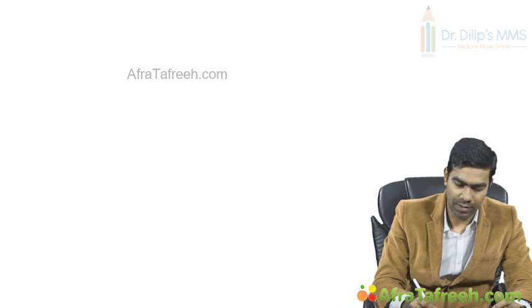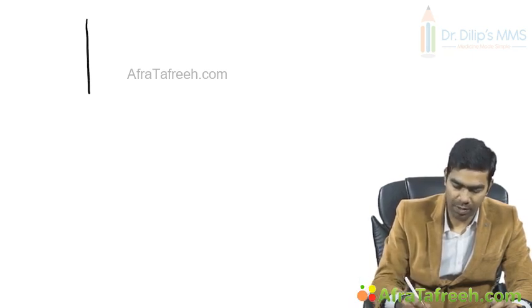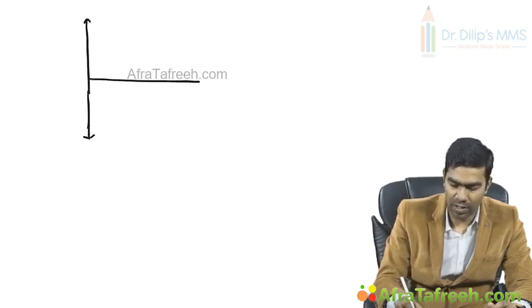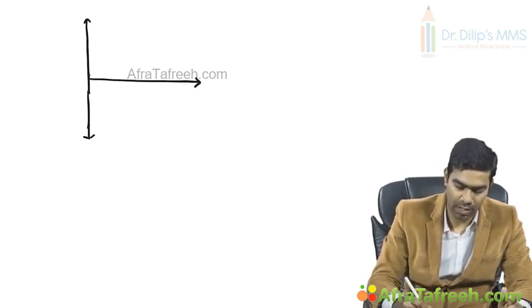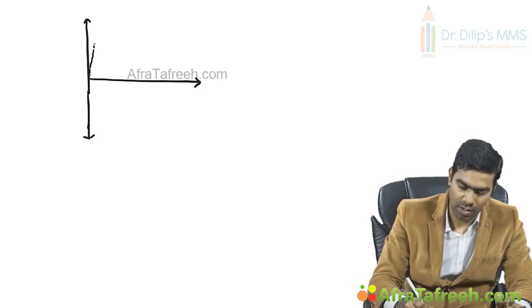Let us see first a typical obstructive flow volume loop. What will happen in obstructive lung disease? So let us put one common thing and we can duplicate it multiple times. Let us put the dotted lines as an indicator of a normal flow volume loop, how it's going to behave.